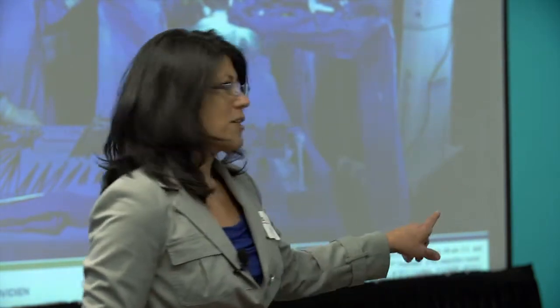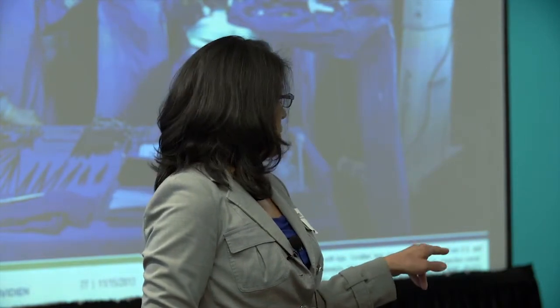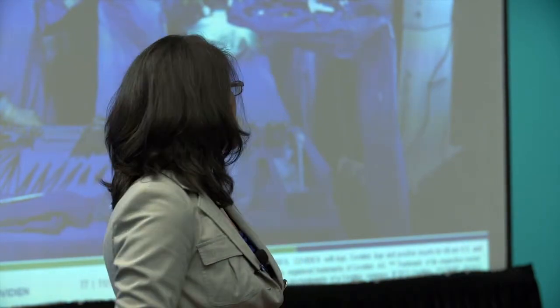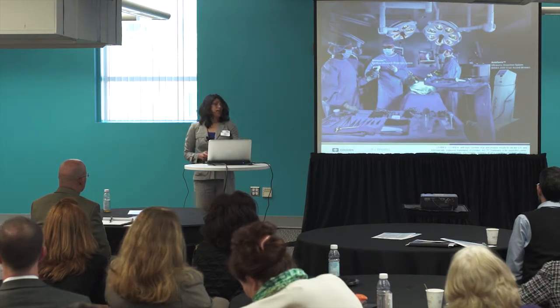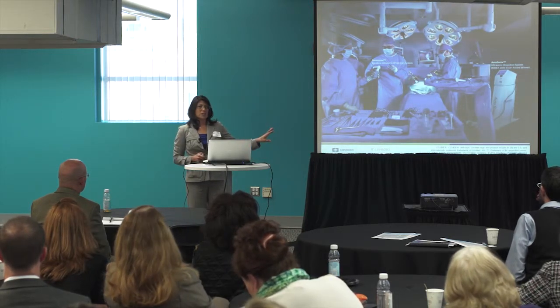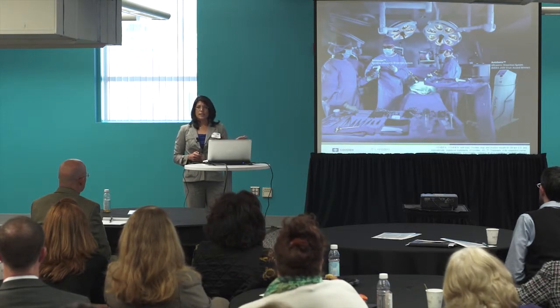The predicate device, which I rolled up here for the product that I'm talking about, is an ultrasonic surgical instrument. There's a generator, which I rolled in on a cart, and a foot pedal. If I had time, I would set it all up for you, but that would take the whole time of the presentation. But I wanted to bring that in as the example. Typically, this is in the non-sterile part of the OR, and the circulating nurse is the person who has to set it up. The device itself that's used on the patient is then transitioned into the sterile field.